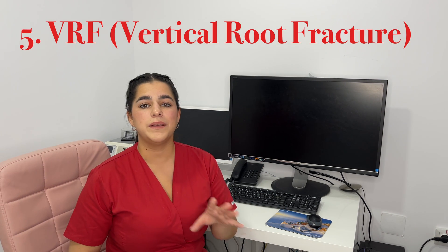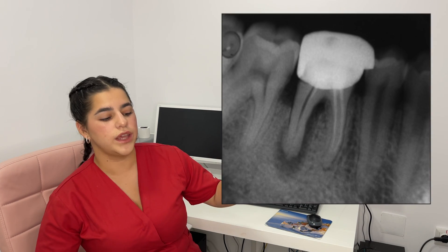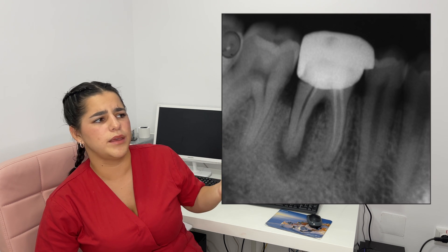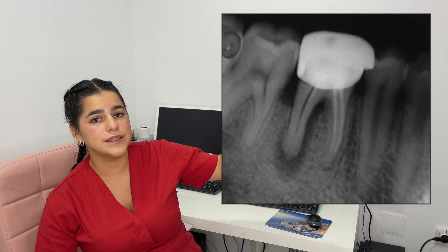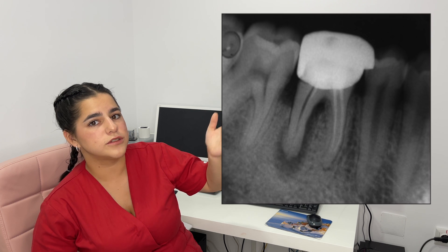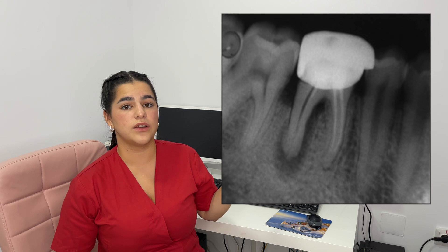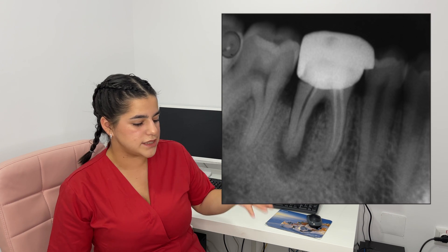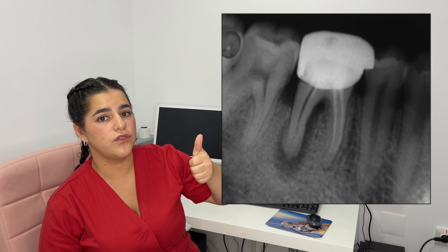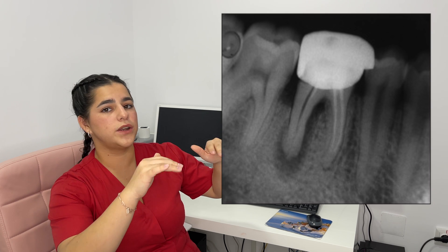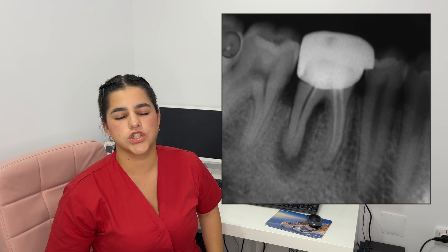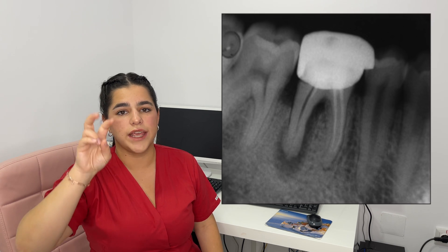Now talking about vertical root fractures — they may be seen on radiographs as a diffuse widening of the periodontal ligament, and we can also see a J-shape of translucency around the tooth. On this x-ray, you can see that bone is affected on the side of the root with the fracture — the bone is very retracted. You might think it's periodontal disease, but looking at the other side of the tooth the bone is intact and fine. This asymmetry indicates we are dealing with a fracture. Always check the bone level on both sides: if both sides are equally affected it might be periapical problems, but if one side is very low and the other is totally normal, that confirms a vertical root fracture. Always look for that J-shape translucency around the root.